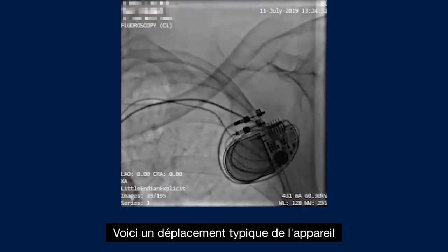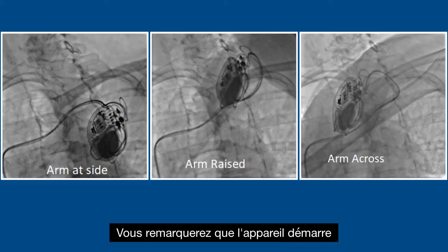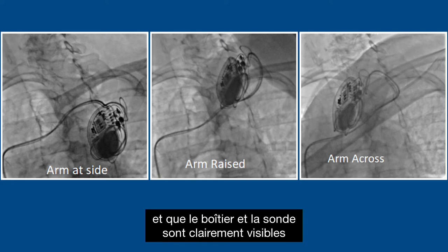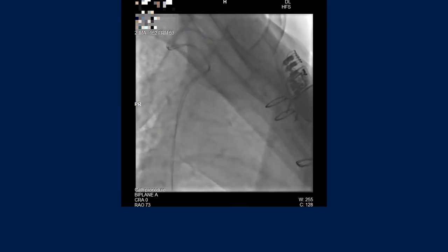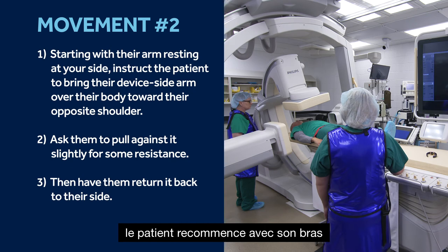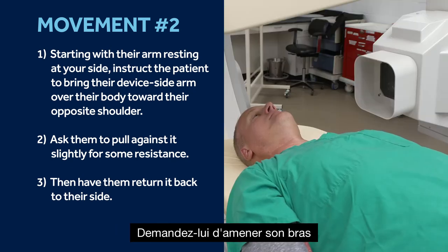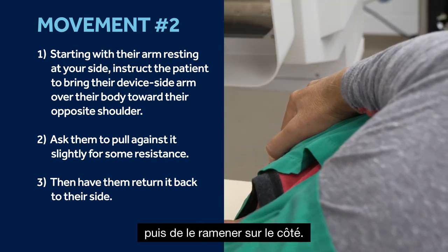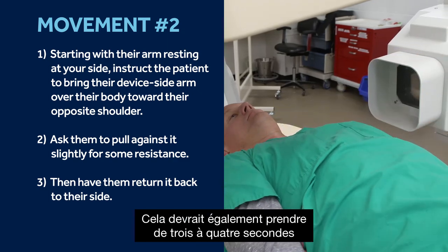Here is a typical device travel for the arm above movement and into the arm across movement. You'll notice that the device starts in the bottom right corner for both scenarios and the can and lead are clearly visible throughout the frame. For movement number two, the patient will again start with their arm resting next to their body. Ask them to bring their arm over toward their opposite shoulder, pulling against it slightly for some resistance, and then returning it back to their side. This should also take three to four seconds each direction.